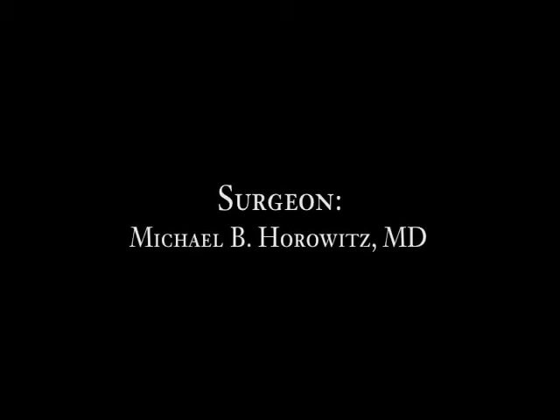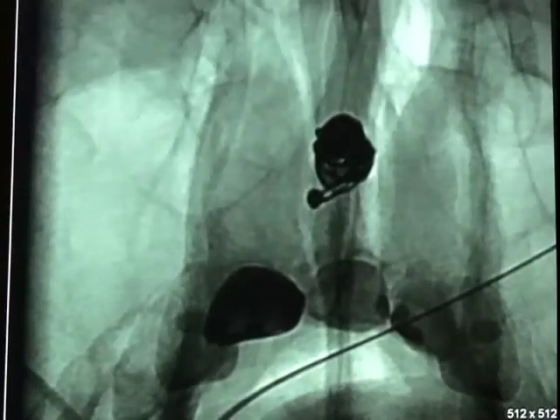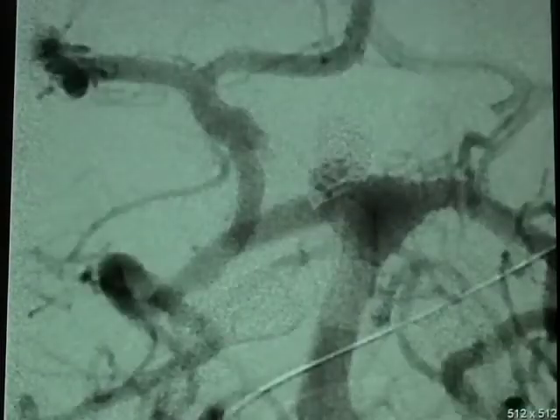Endovascular coiling, previously coiled basilar apex aneurysm. Using neck remodeling device. This was in February 2012. The surgeon and narrator are Dr. Michael Horowitz. Here we see a previously coiled aneurysm.